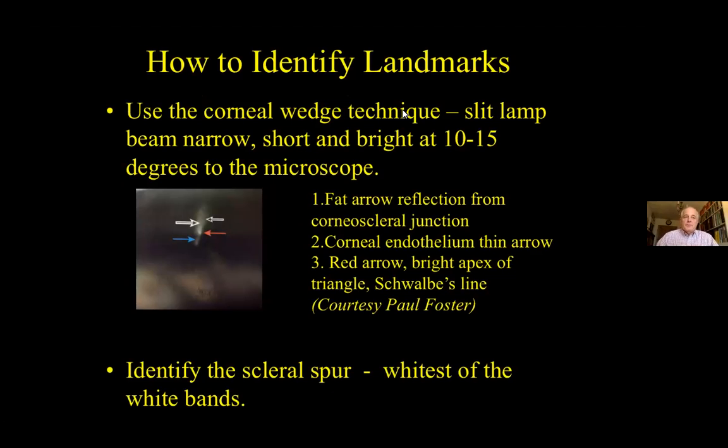Sometimes things can be hard, and there are various techniques that can help. The corneal wedge technique uses the slit lamp with a narrow short bright beam at about 10 to 15 degrees to the microscope. You're trying to see a wedge pattern: the anterior arm is formed by the reflection from the corneoscleral junction, and the posterior arm by the reflection from the corneal endothelium. Where those two meet it gets a little bit brighter, giving you an indication of where Schwalbe's line is. Practically speaking, if I can identify the scleral spur I can normally work out what else is going on — and that may mean indentation. The scleral spur is normally the whitest line.